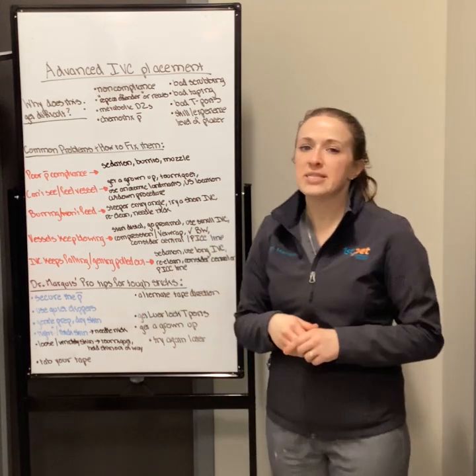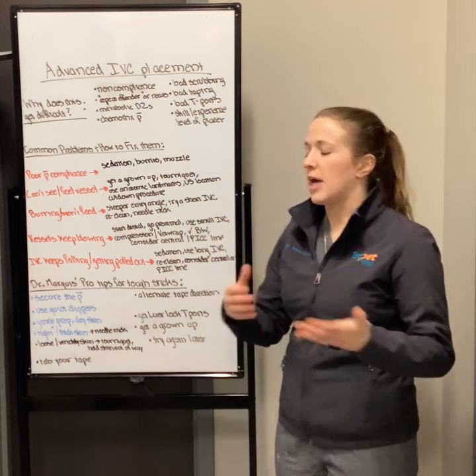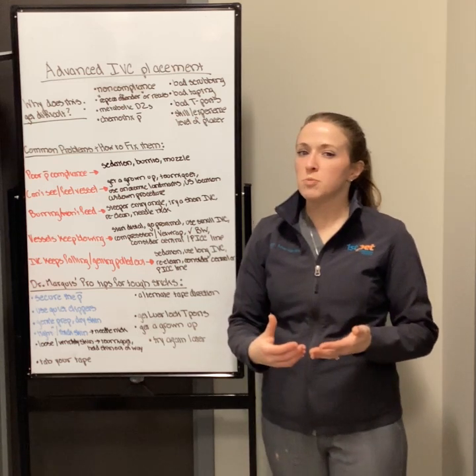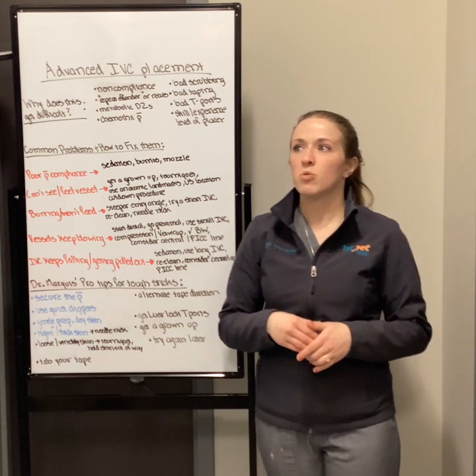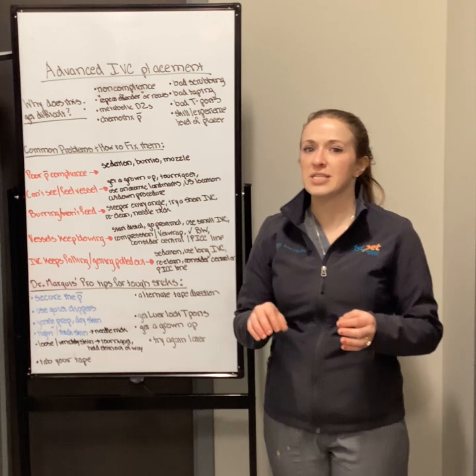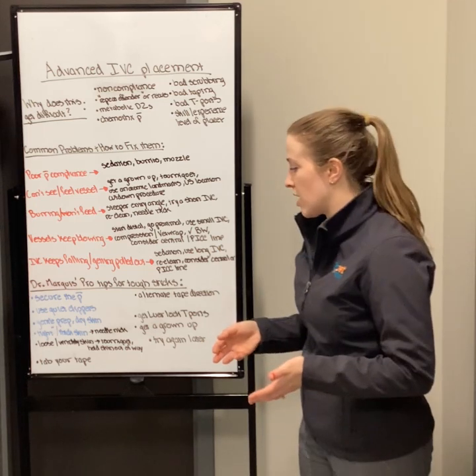This is also the case in animals that are intact, so they're not neutered, they're not spayed. That is the way their skin behaves. I would strongly recommend a needle nick in those patients. Again, not every dog or cat is going to need that, but if you have an intact older male Labrador or an older male pit bull that has really thick, tight skin, then I think using the needle nick can be very helpful in those scenarios.